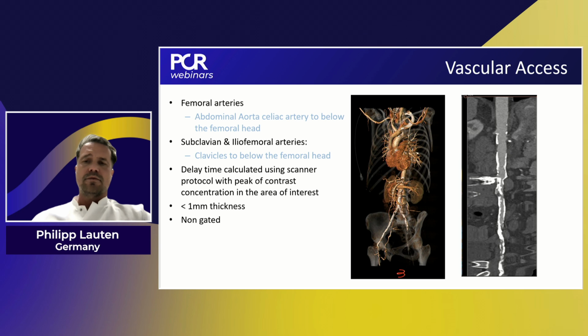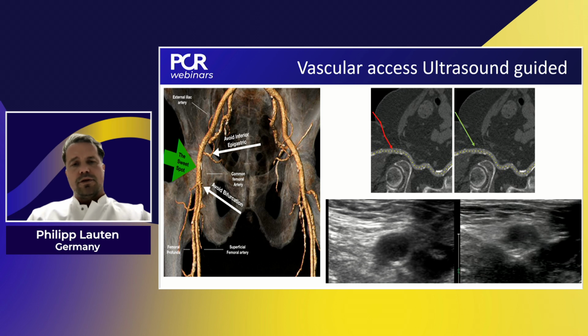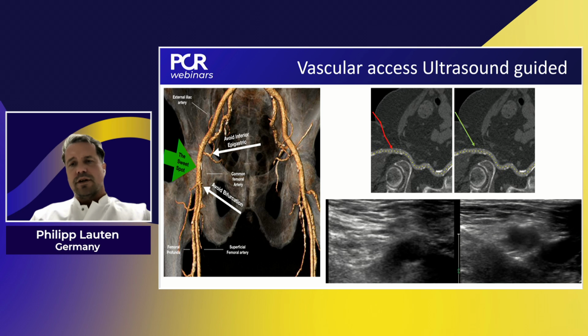We know in patients with a small anatomy, there are very often small femoral arteries. We scan the clavicles to below the femoral head, even for the idea for alternative access, if transfemoral approach, like you see on the right hand of the slide, is not possible. And this is even in the data set for the heart team evaluation mandatory to use the view on the vascular access, even for the success of the valve implantation afterwards.